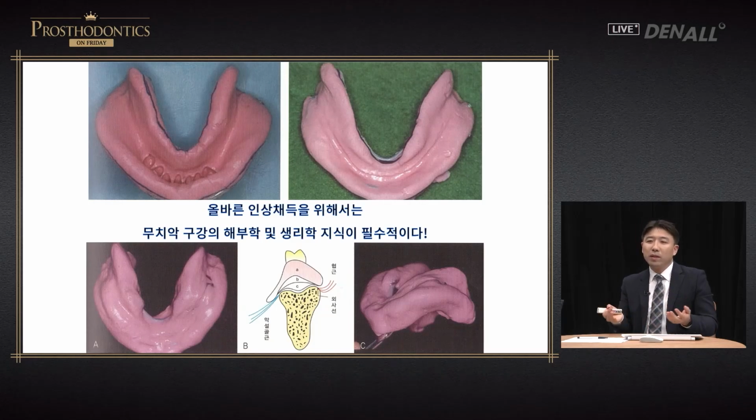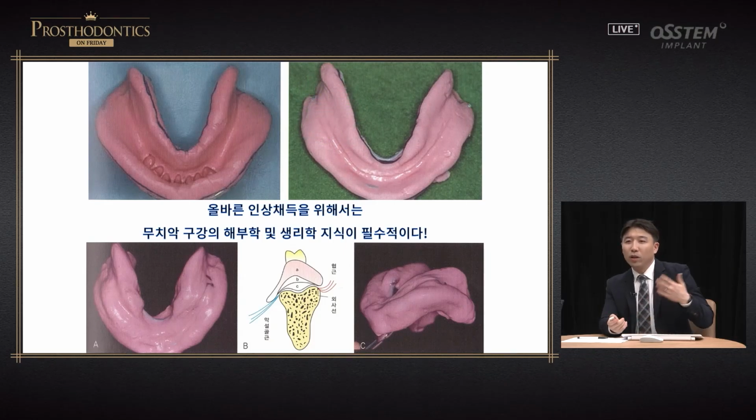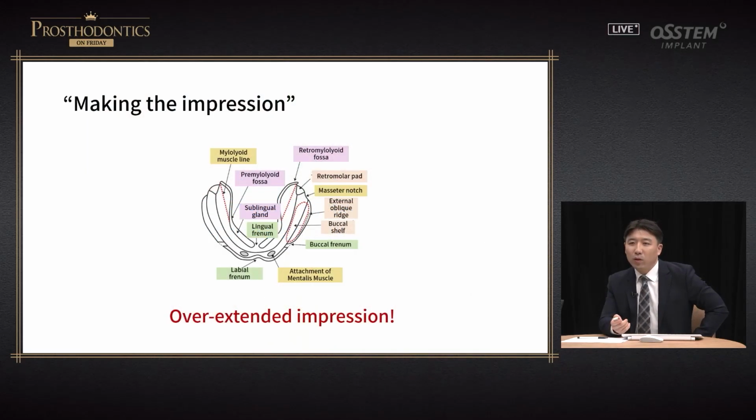When we take a preliminary impression, this kind of form needs to be gained. The muscle is activated and the S-curve has been formed. Then you need to check whether this kind of form is gained. If you do not have any knowledge of anatomical structure, it is very difficult to gain. All structures need to be reflected, and this has been explained.